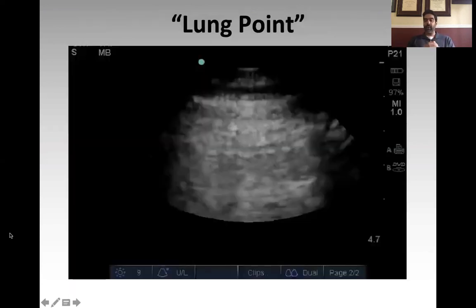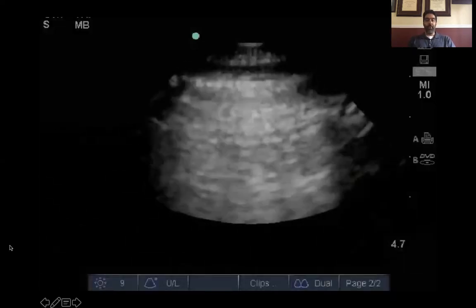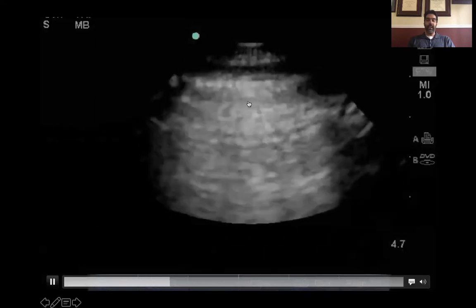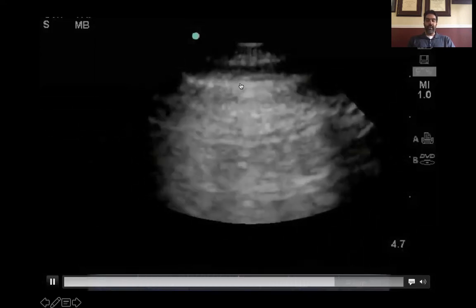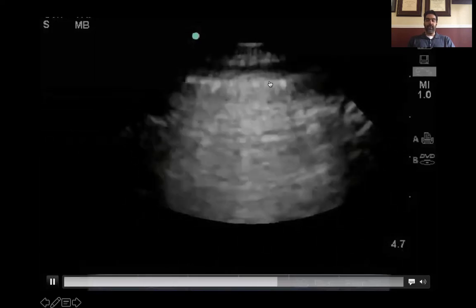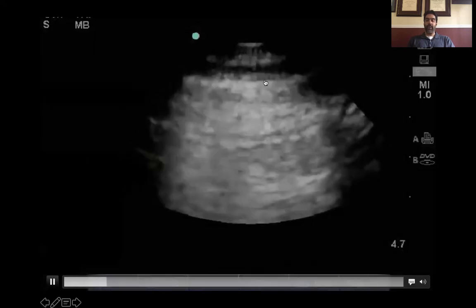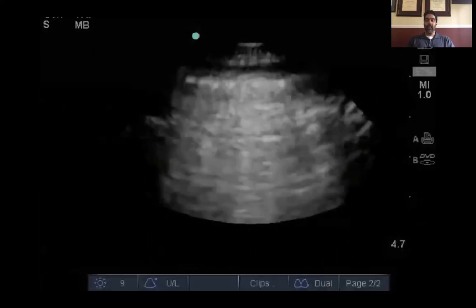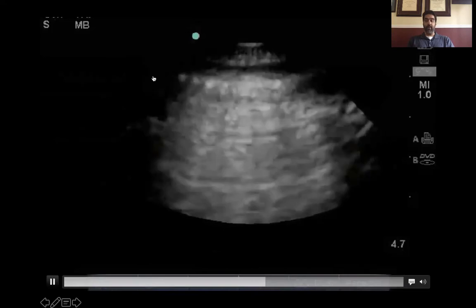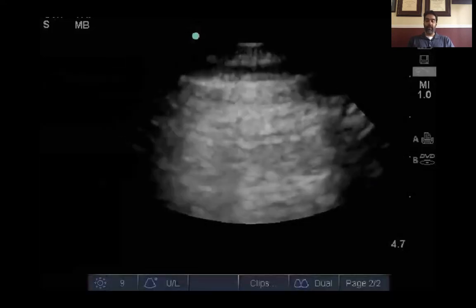Absence of lung sliding is fairly nonspecific and does not necessarily mean there's a pneumothorax unless your pretest probability is high. However, if you see a lung point — a transition point between normally sliding lung and not-sliding lung — this is a fairly specific ultrasonographic finding for pneumothorax. It represents where the pneumothorax begins, the transition between normal lung and pneumothorax. If you see this, regardless of pretest probability, it is very likely a pneumothorax and I would act on it.